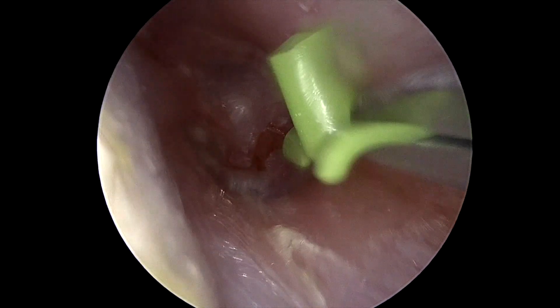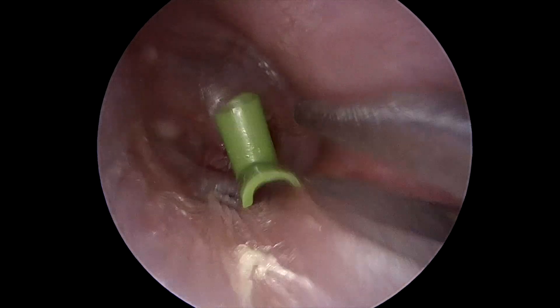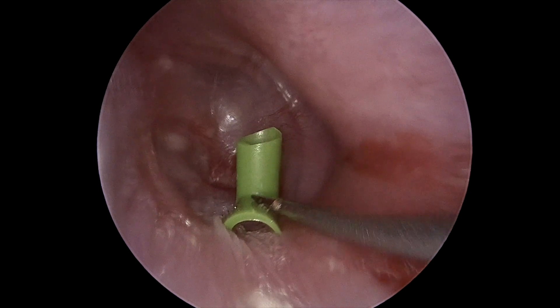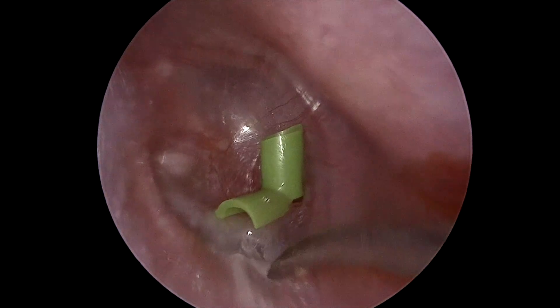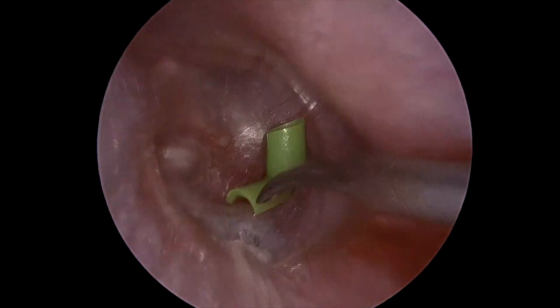A T-tube is then brought into the field and placed near the myringotomy. Using a rosen pick, the anterior flange is dunked into the myringotomy. The posterior flange then snaps into place and the lumen is directed perpendicularly outward.